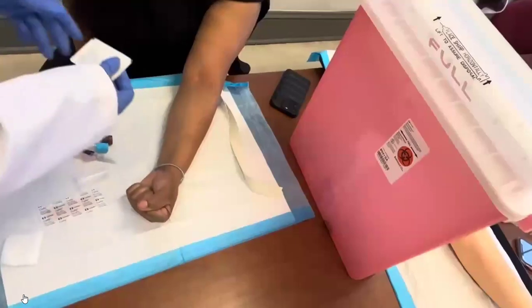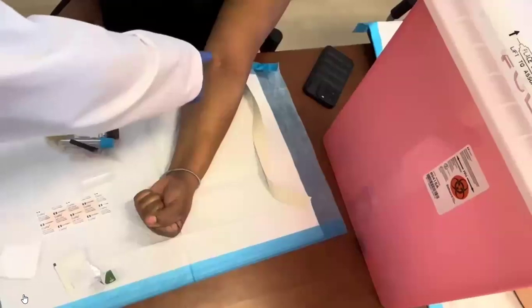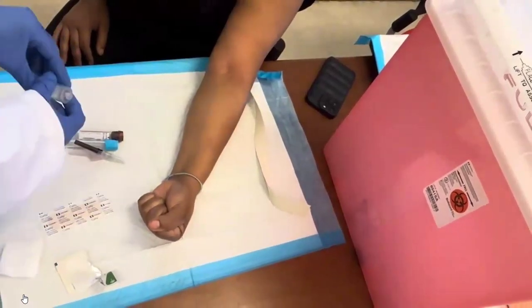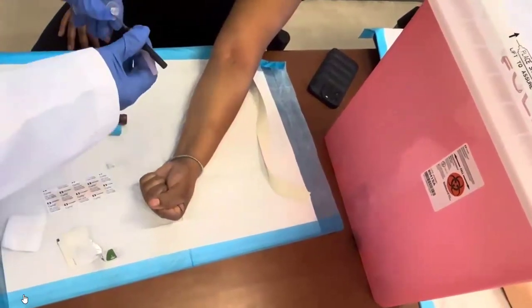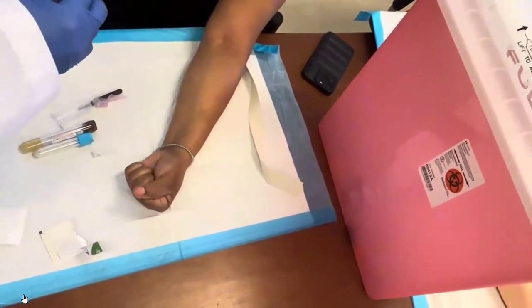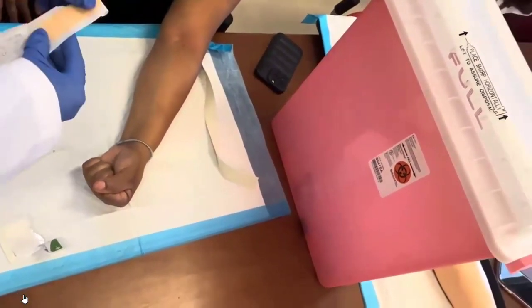All right, I'm going to go ahead and clean it. And when we clean, we want to clean from the inside out, circular motion. Wherever you're going to stick, you want to just wipe there and then keep working your way out, okay? All right, so while that's drying, I'm going to go ahead and get my supplies together. So I'm going to assemble my needle there. Put that there. I'm going to open up my Band-Aid because we want everything all ready together. We don't want to stick our patient and then have to do all of this. We want to have everything already ready.